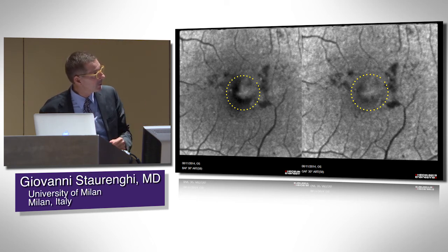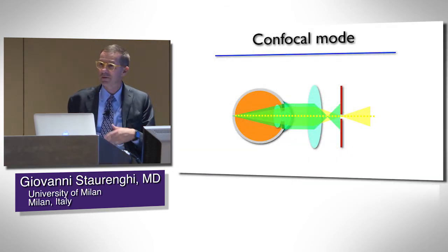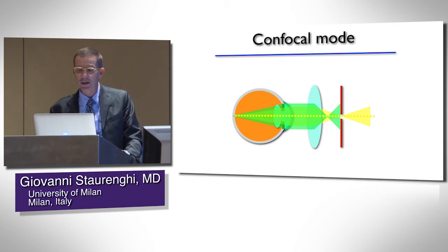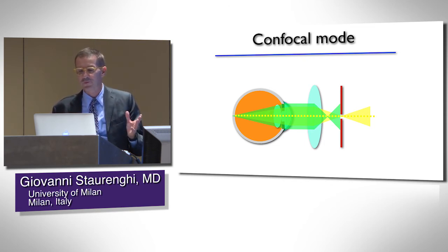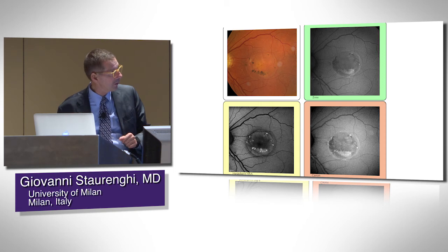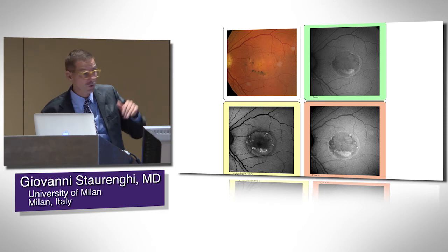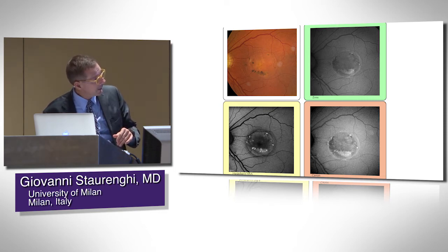Here is another example of two different wavelengths — you see the dark spot in one and its absence in the other, and another case with the cyst visible in blue but not in green. The confocal aperture allows you to see the specific layer you are interested in, as you don't collect light coming from surrounding areas. That is important for excluding lens fluorescence. Here is another example showing the confocal advantage — you can see this melanolipofuscin at a different level compared with the increased fluorescence in a vitaliform lesion.